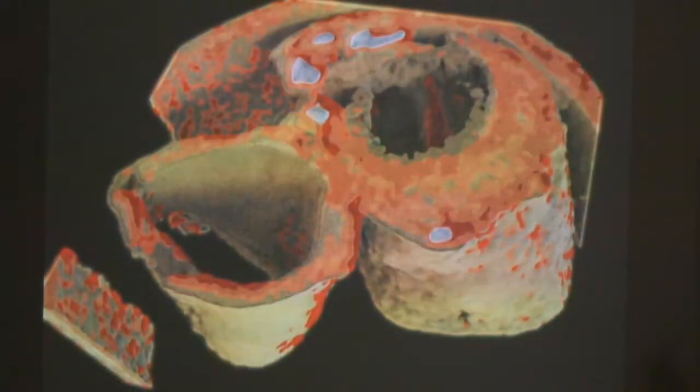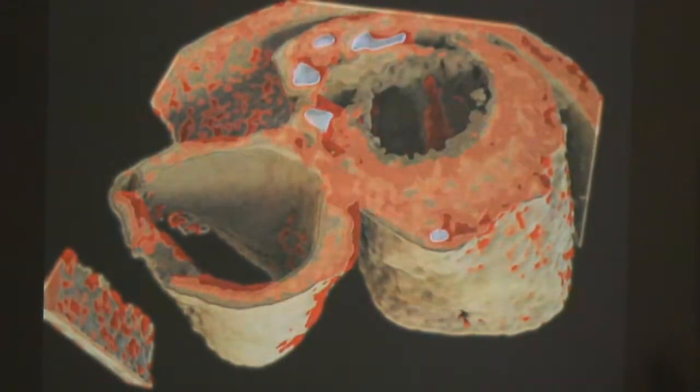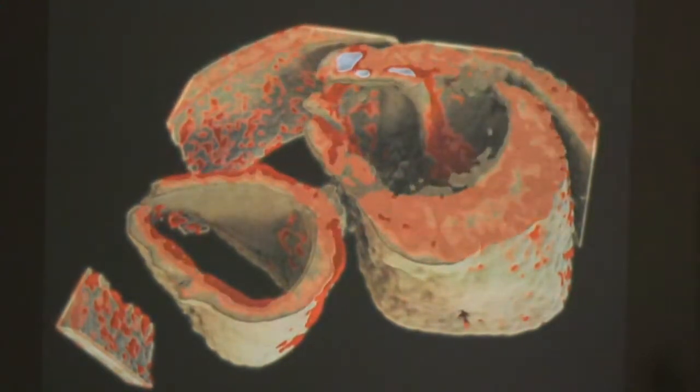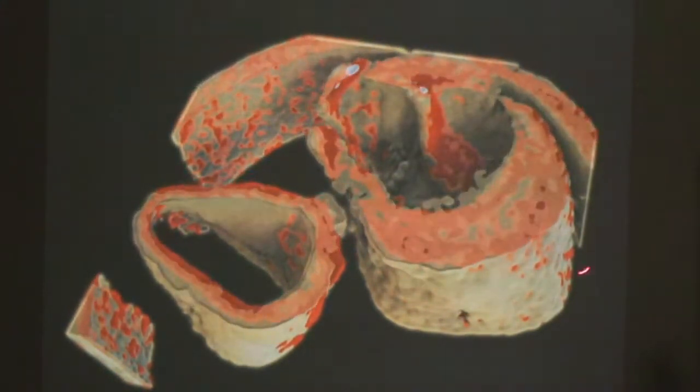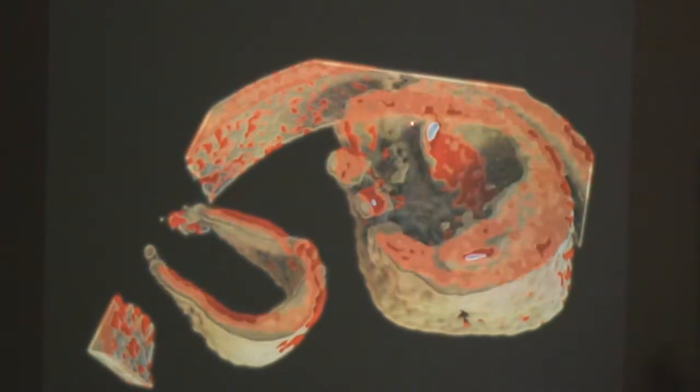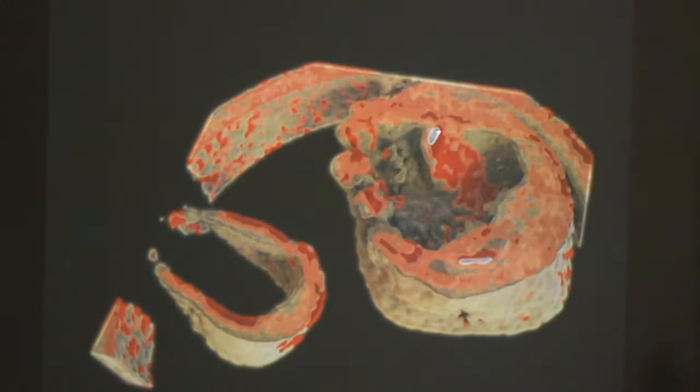This is slicing through the stomach. So remember, this is towards the heart, and that's towards the brain. And then you go fat, water, mixture of both. So these pink areas are a mixture of fat, water, and calcium.